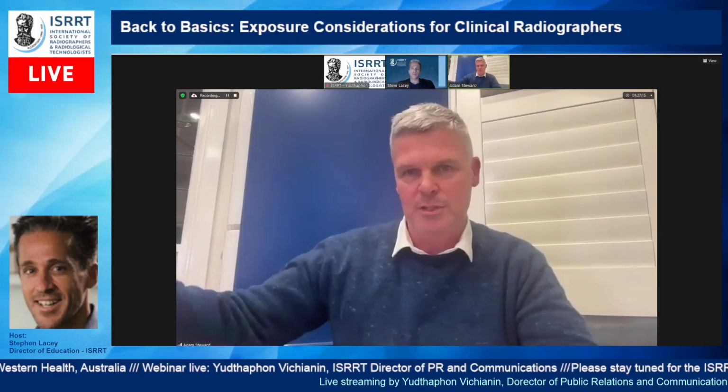The exposure index is a literal measure of the exposure at the detector, as opposed to DI, which is a deviation from it. So it's basically saying this is how far it's deviated from what the dose expected. So it's not super scientifically robust, but particularly with the GE system and other systems that use the DI, it's a pretty simple way of going. One step is 25%, which you're familiar with every time you step up an mAs, and doubling or halving is about 3. So it's a deviation index.